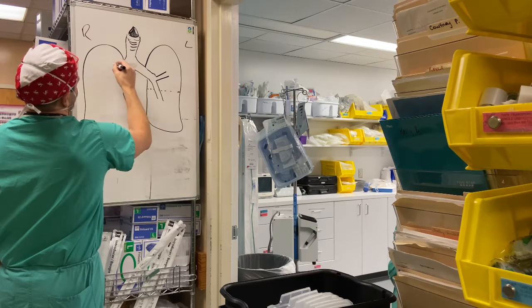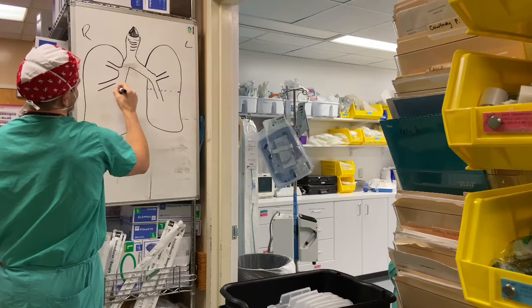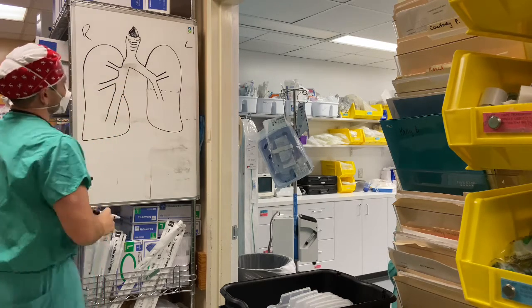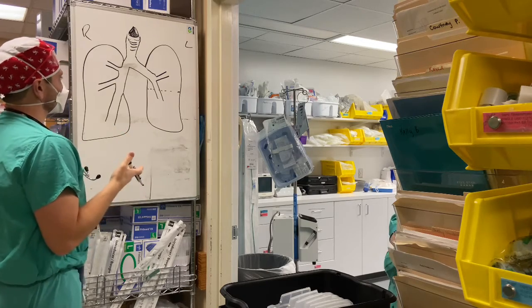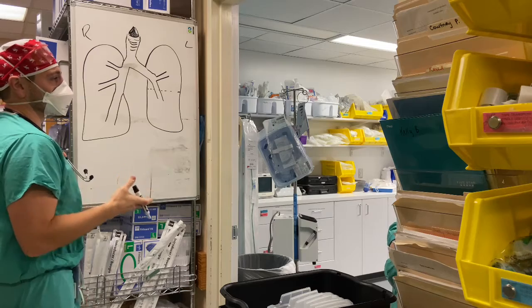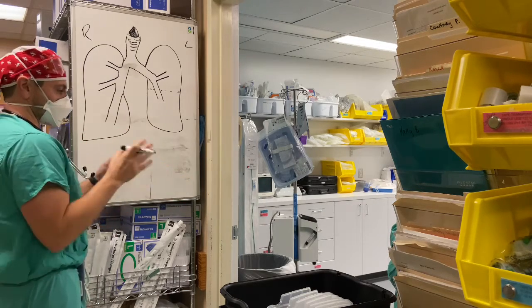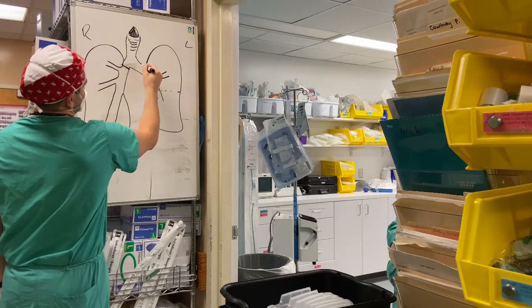So you've got an upper, you've got a middle, and you've got the lower. So when you put a double lumen tube down, it doesn't matter which side you're operating on, you just need to make sure that you can occlude the major takeoff to either side. So right here or right here.